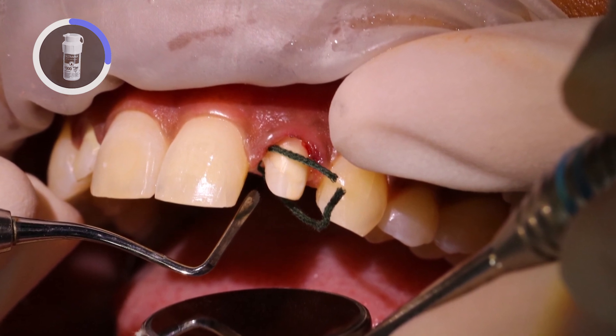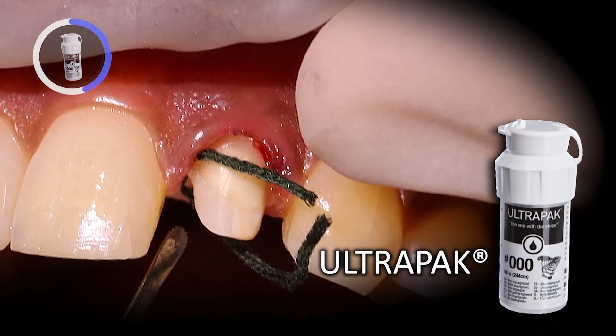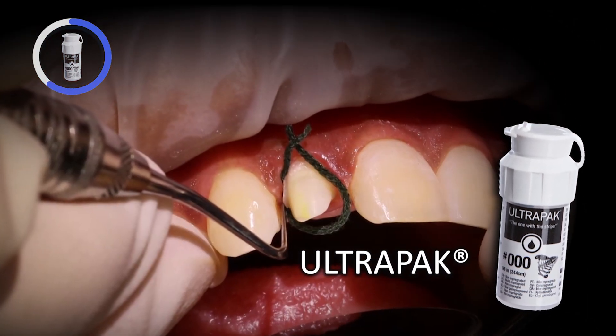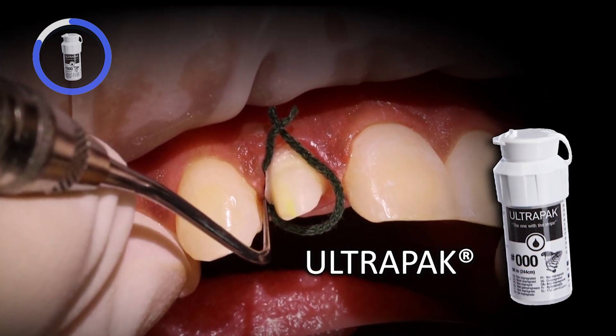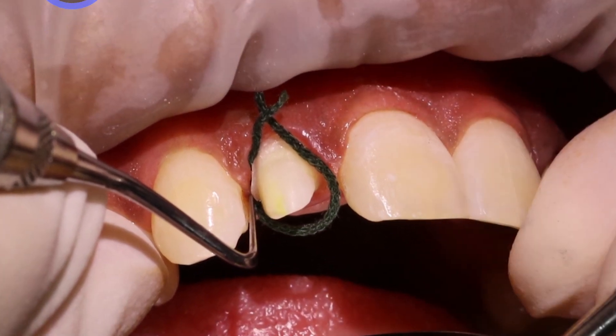To expose a bit more of the prep and protect the sulcus from excess cement, I pack a size triple-zero cord around both teeth 7 and 10. If placing cord before cementation, ensure it's packed deep enough beyond the margins — otherwise cord getting trapped under your restorations would be a very bad day at the office.